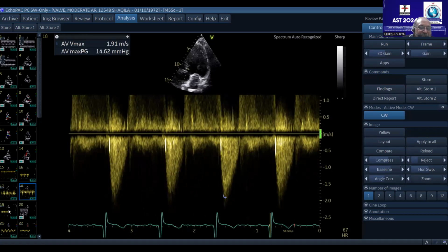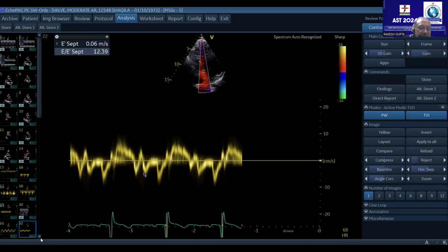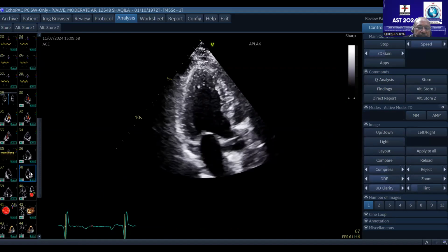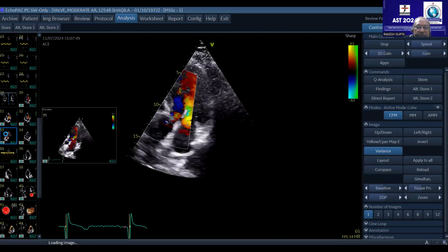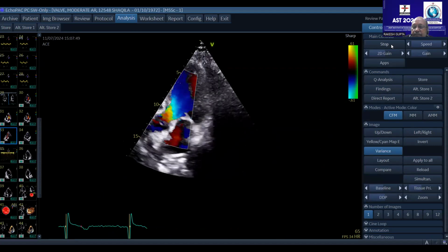I don't think I recorded pressure half time, so that's why it's not showing. Let me try whether I've recorded it or not. Unfortunately, I have not recorded pressure half time. I should be able to record it if I'm comfortable.